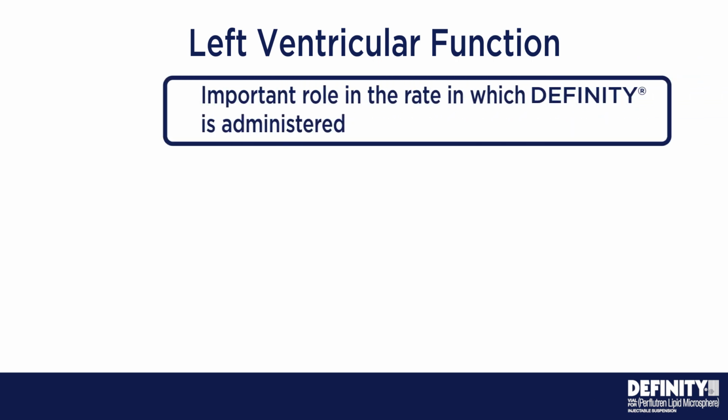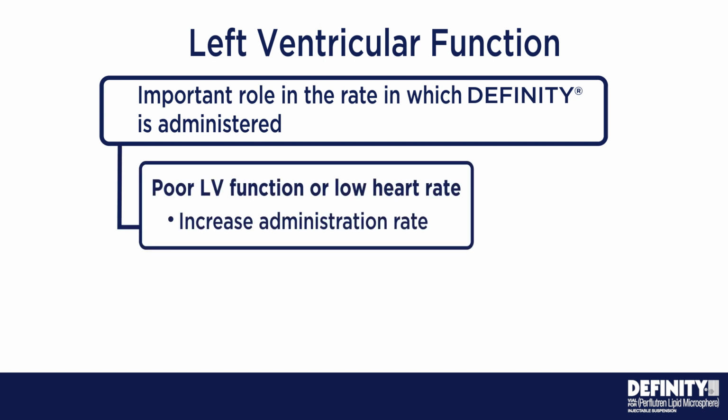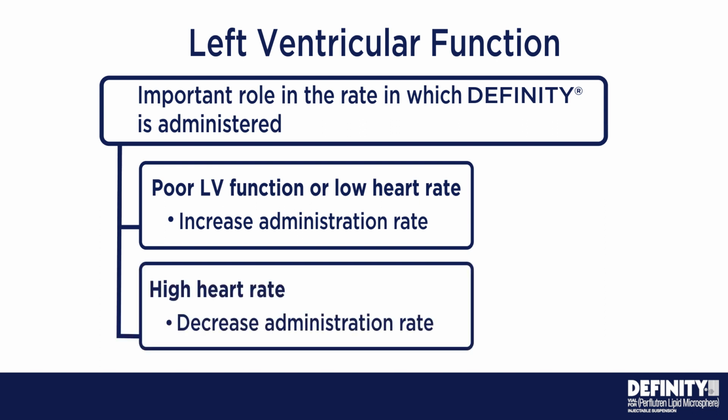Left ventricular function plays an important role in the rate at which DEFINITY should be administered. Poor left ventricular function, or a very low heart rate, may require a more rapid administration rate to allow the microbubbles to completely fill from the base of the left ventricle to the apex, where a high heart rate may require a decreased rate of administration. Let's look at how the rate in which DEFINITY is administered can affect image quality.